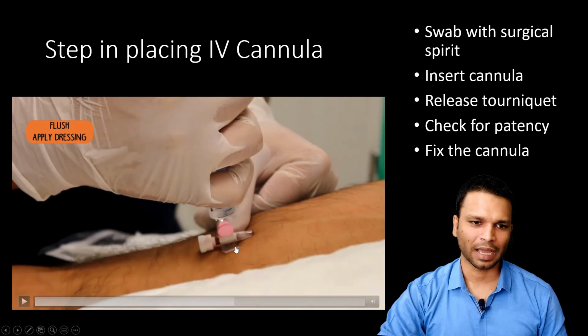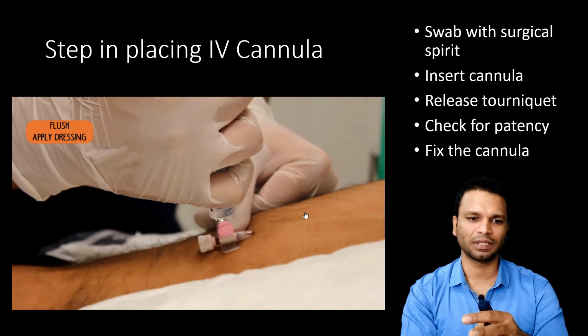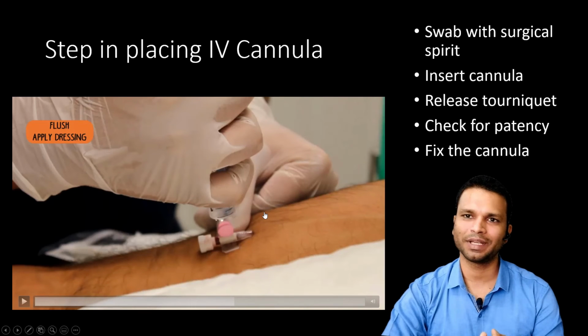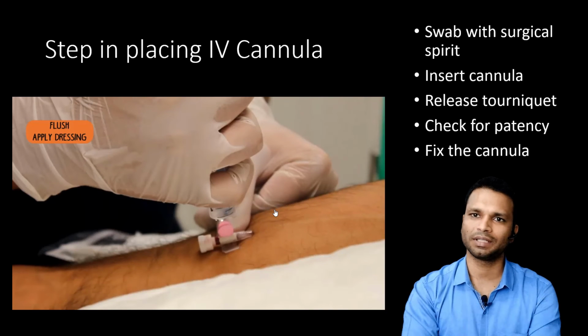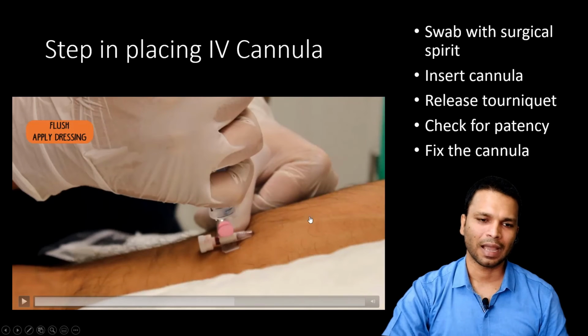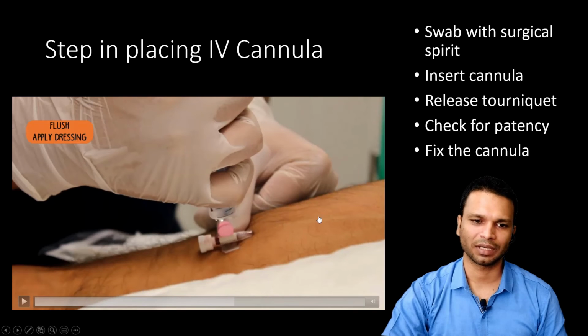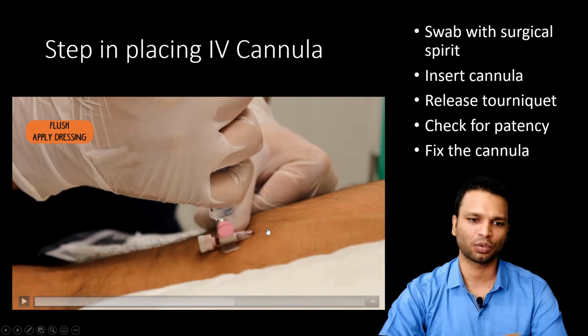Okay, if the cannula is out of the vein, it is not inside the vein, and if you push the normal saline, what happens is the normal saline is deposited in the subcutaneous layer of the skin. So the patient will experience pain because there's a solution being deposited suddenly in the subcutaneous region. So because of the pressure, the patient will feel some pain and there will be swelling seen clearly. Okay, clearly evident swelling will be seen. Whereas if the cannula is inside the vein, you will not see any swelling because it is directly added to the blood and it is being redistributed throughout the body.